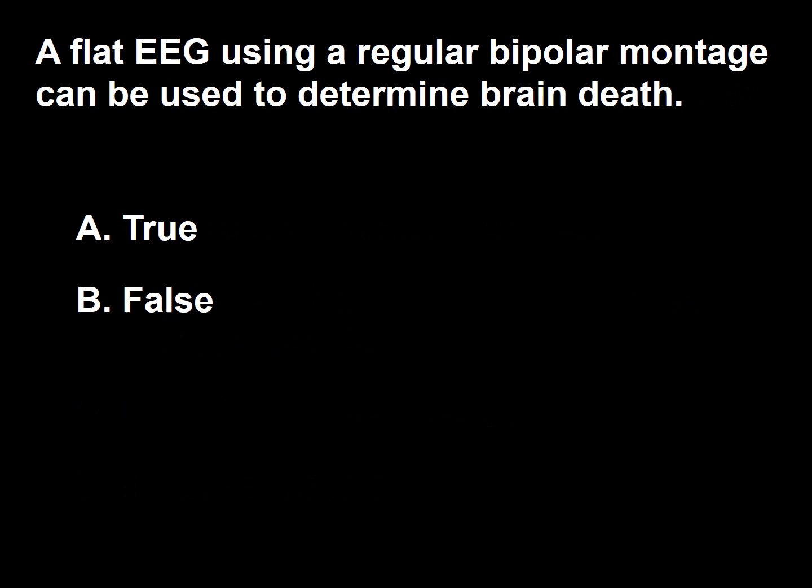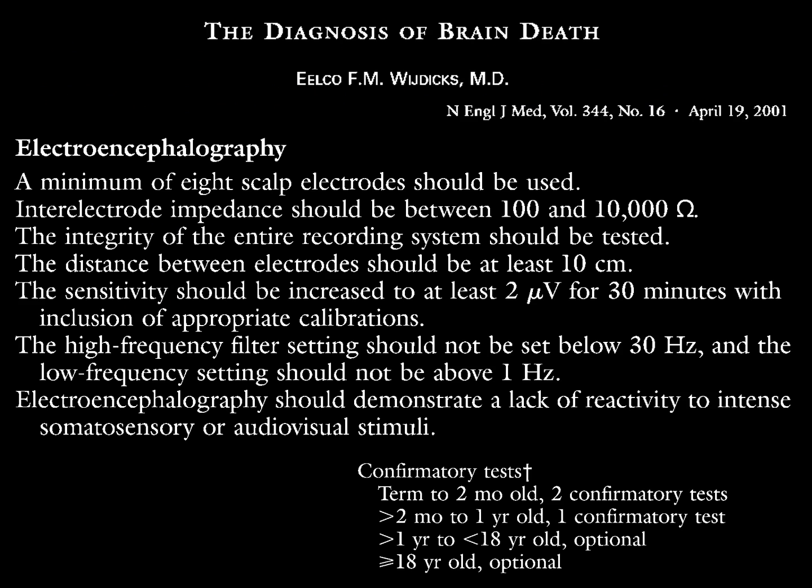Next question. A flat EEG using regular bipolar montage can be used to determine brain death. A true, B false. This frame shows the technical recommendations that must be met when diagnosing brain death. Take a few seconds to read them over. I'd especially like you to pay attention to the 10 centimeter rule.